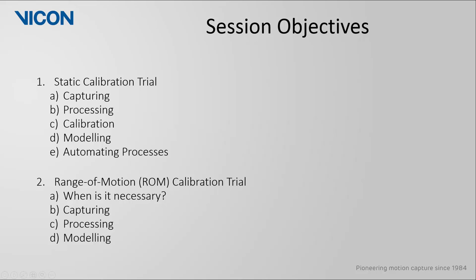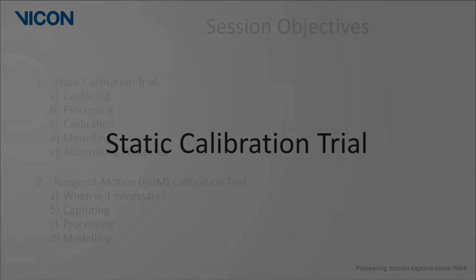Lastly, we will look at how to make this initial step of calibration and modeling more automated. For the ROM trial we will first discuss when such a trial may be necessary, then how to go about capturing and processing this trial. We will then look at how to model after calibrating the template.